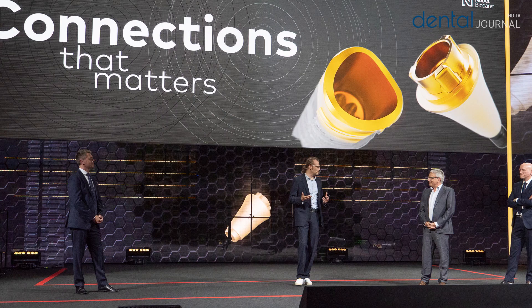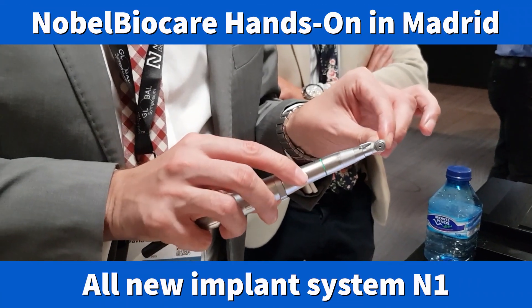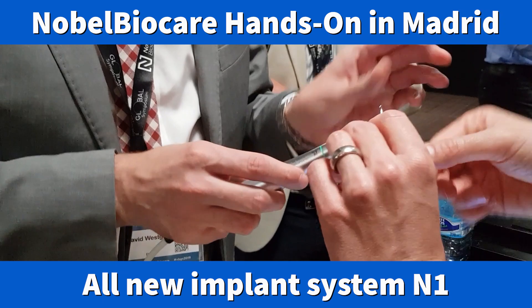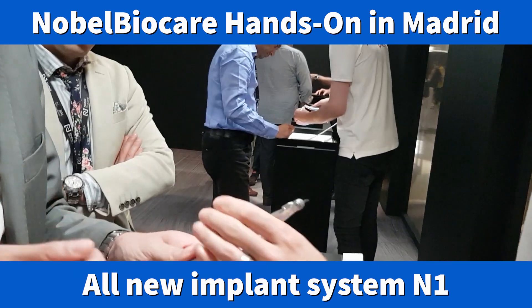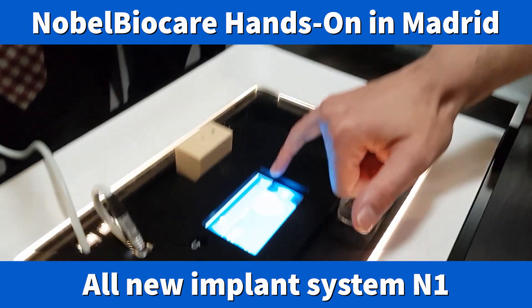At the Nobel Biocare Global Symposium we had a chance to do a hands-on with the new N1, and what we tried out is the new drilling process.